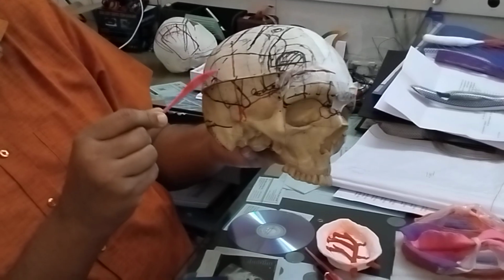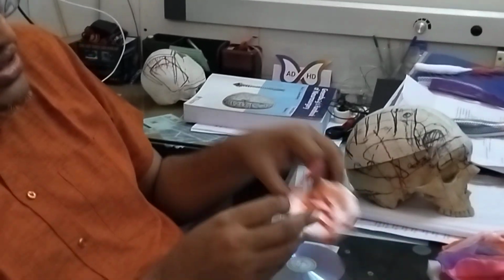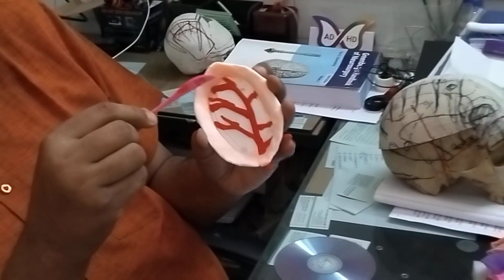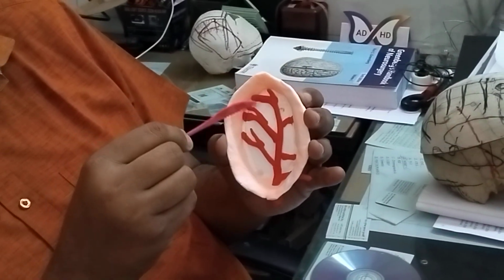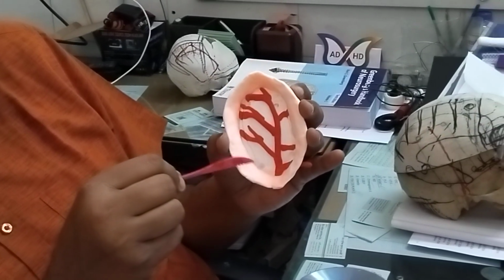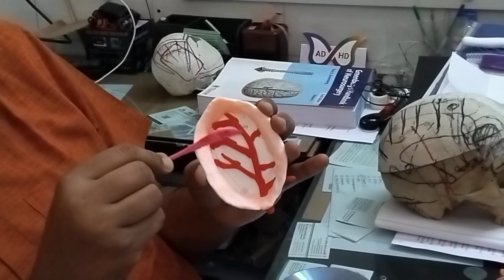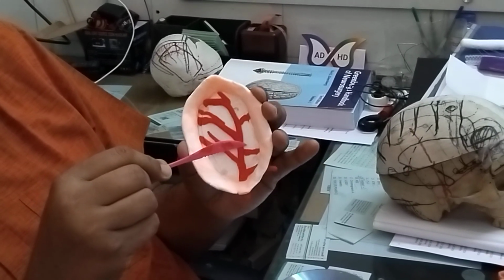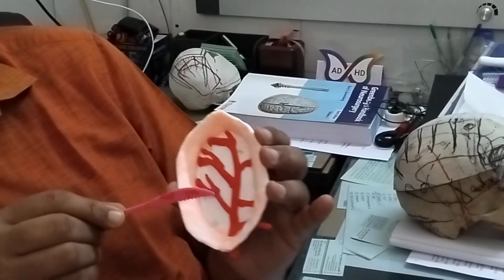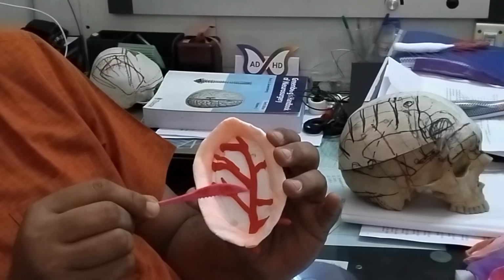And what we do first, we give an incision over the skin. Some give a sigmoid shape or lazy S incision over the skin, but now we practice an incision over the blood vessel, as we detect the parietal branch of the superficial temporal artery by Doppler ultrasound.